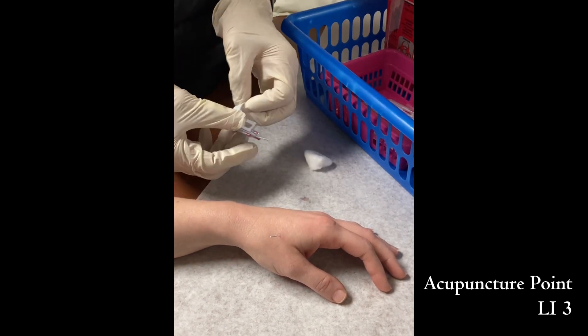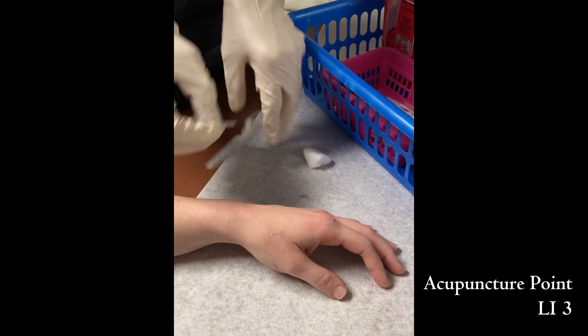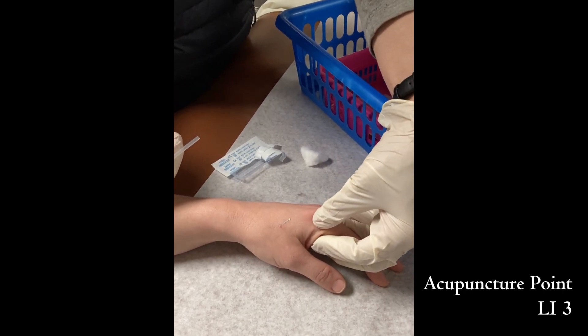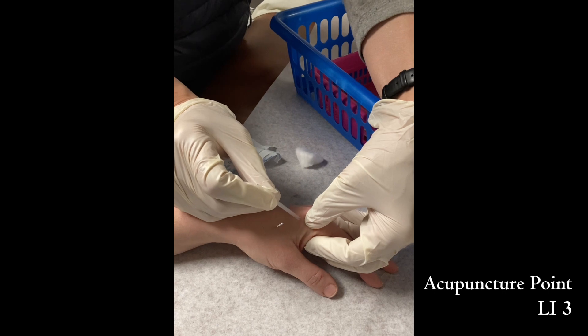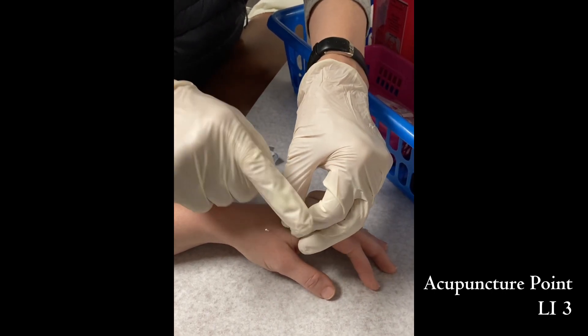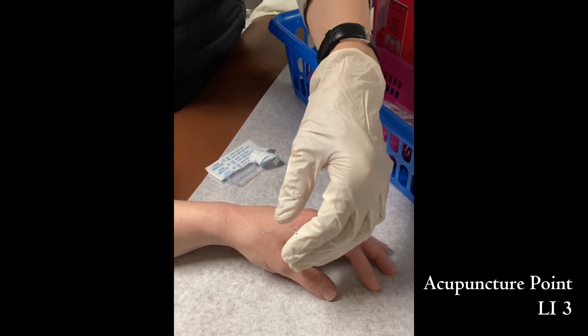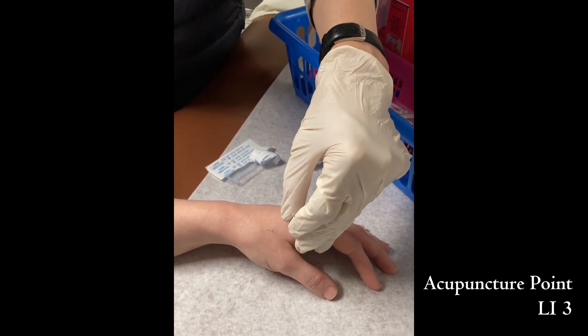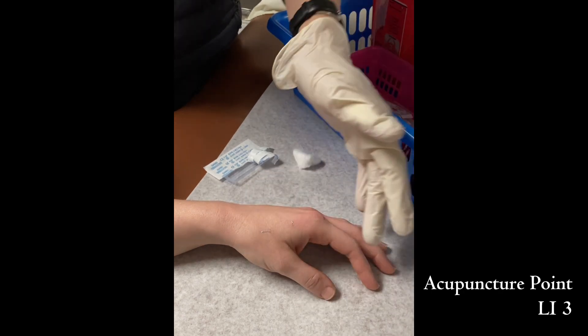We get the needles ready, with my hand back on the metacarpal head, feeling where the turning point is, and push the needles in. Tap the needles in and insert — that's good.